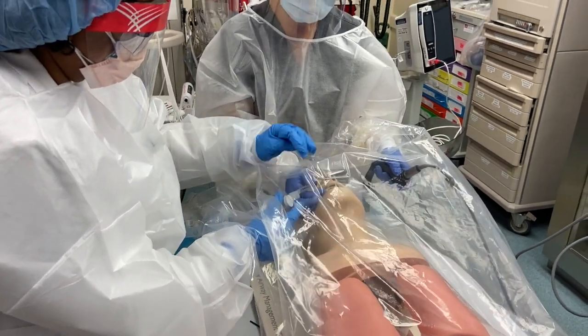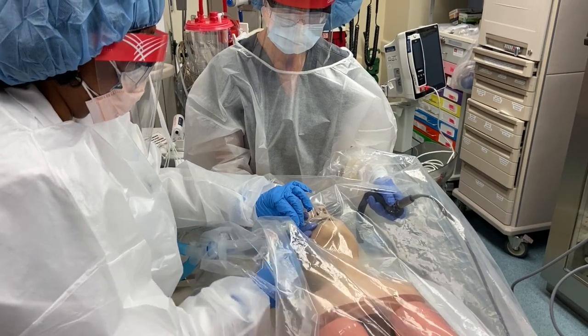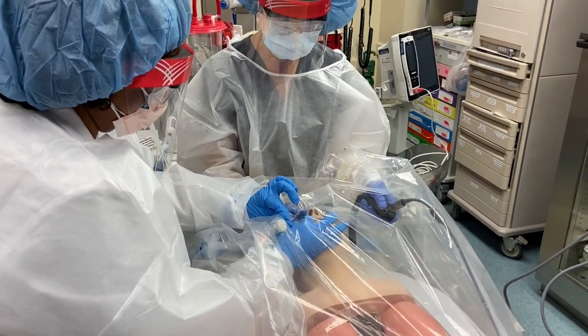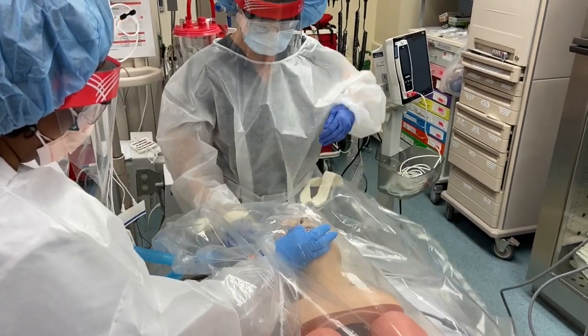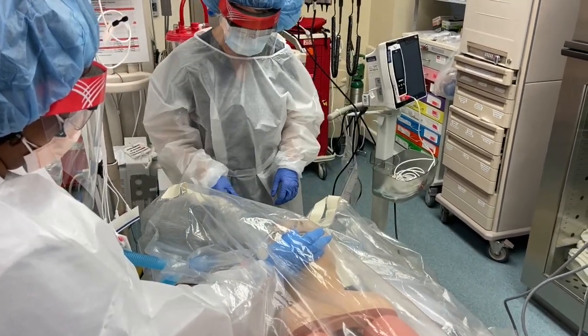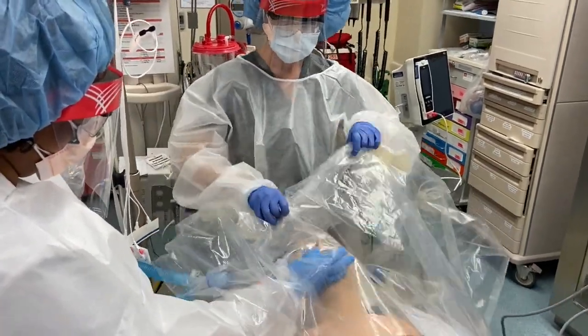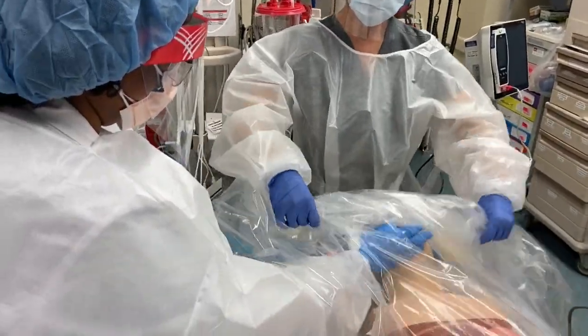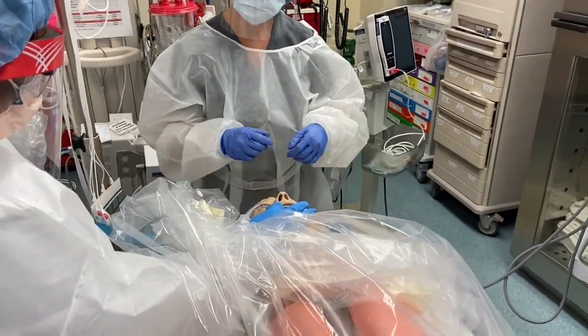Notice also that the respiratory therapist continues to use a one hand under and one hand over technique to secure the tube. After this, the respiratory therapist continues to hold and maintain the ET tube in place. The operator removes both hands and begins rolling the drape from underneath in order to avoid spreading any aerosolized materials that might be on the inside surface of the drape.